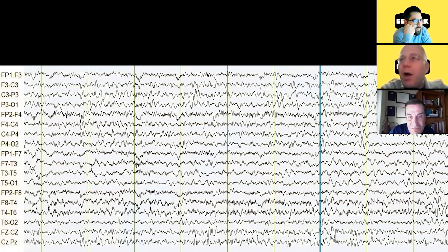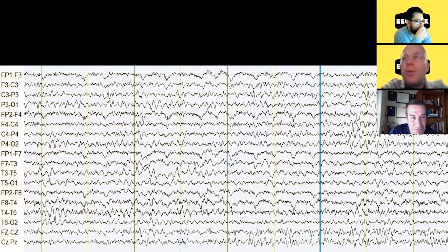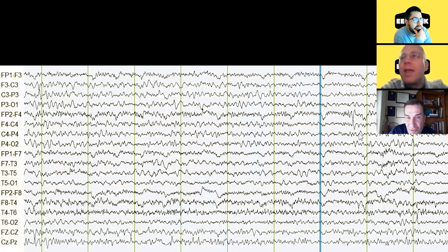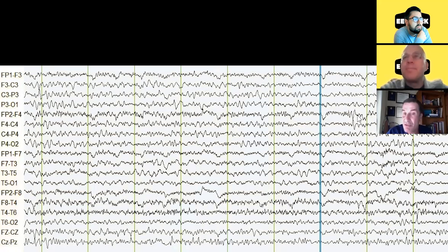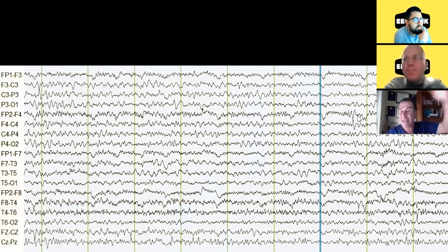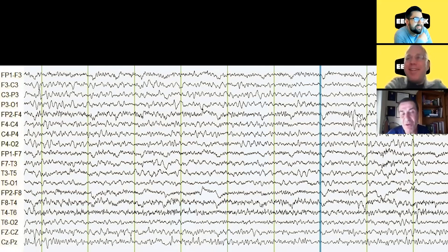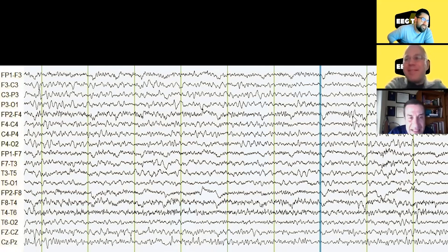Can we pause on one of those and go through carefully the points for and against it being epileptiform? Yes — there is a phase reversal indicating that particular wave has maximum negativity at F4. Why is it not epileptiform? The main argument is it does not clearly stand out from the background. There is no absolute voltage criterion — it's more about whether it stands out. Some people like to say 'would it hurt if you sat on it?' — probably not.